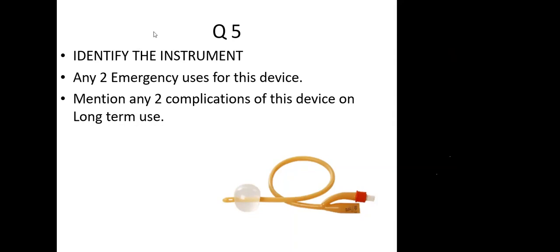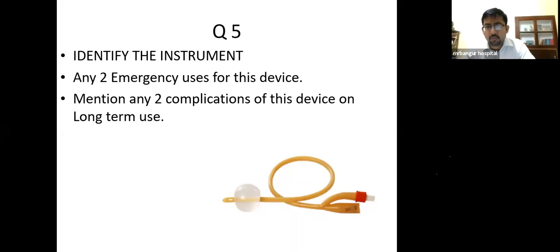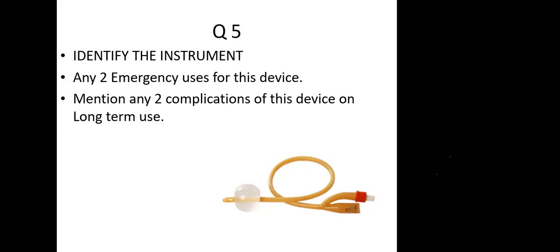We can pass on the next one. Sir, many complications on long-term use. Yes, please tell me that one. Infection and blockage. Where is the infection, sir? Sir, urinary tract infections. Okay, so number one is a urinary tract infection.